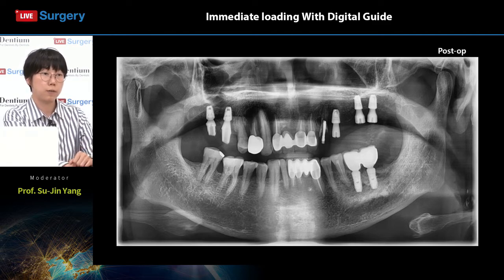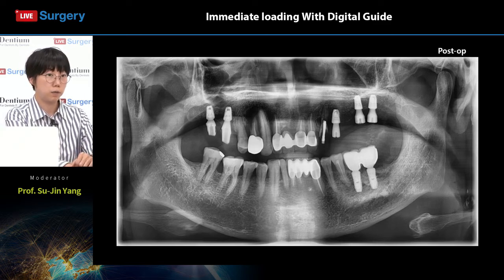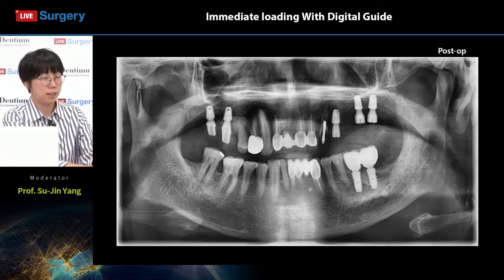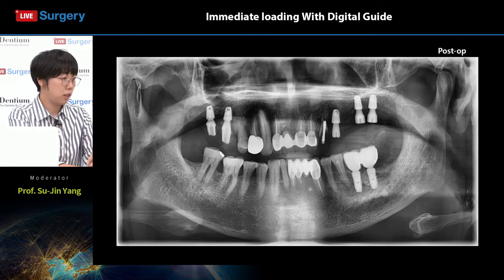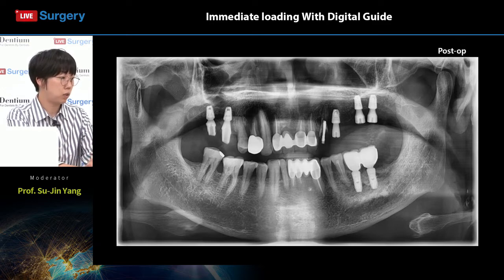Okay, so we have 2 questions that have come in. Question number 1 was, what are the criteria for selecting an abutment in a full case and the tips for provisional? This is a very wide topic that some very famous lecturers could talk about for over an hour, but to just convey my opinion, I think first it is very important to choose the implant places where you have achieved the best initial support.